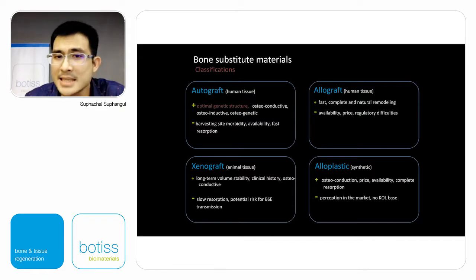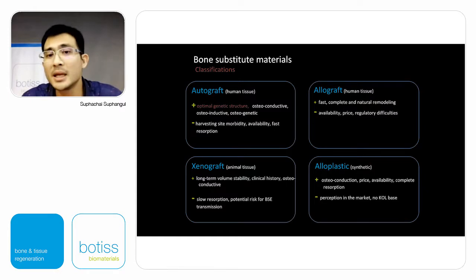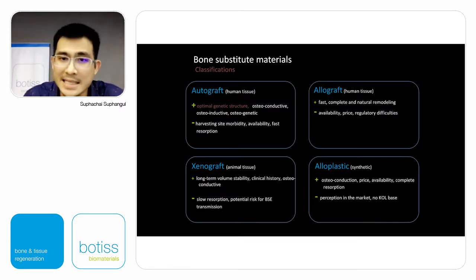But the disadvantages of the Allograft are availability in some countries, where regulation does not allow the use of allograft, and the price. Because it needs to come from a donor, sometimes there are not enough donors to get the allograft.